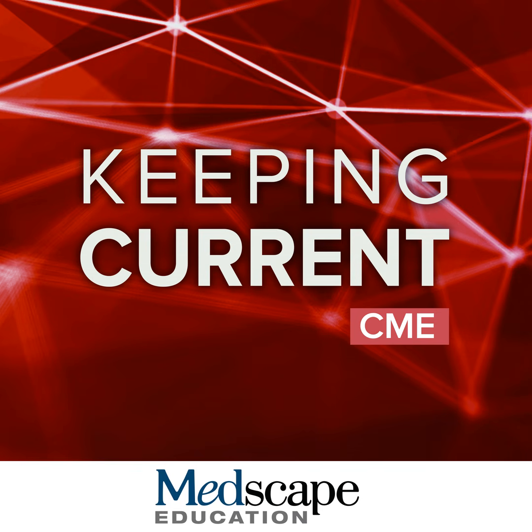And then we have what's called the intermediate range or gray zone between 10 and 30. And this is where you're going to have some scans that are visually positive and some that are negative. And there are different cutoffs that trials have used, whether it's 20 or 25, versus research studies.